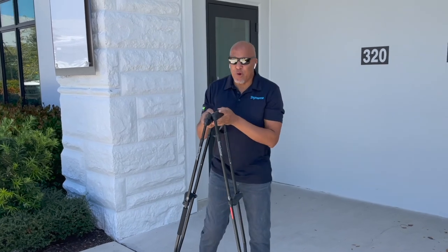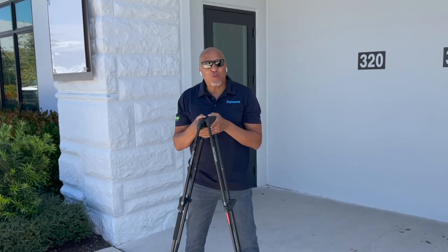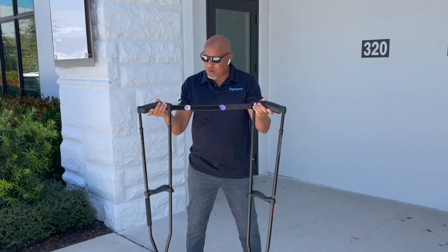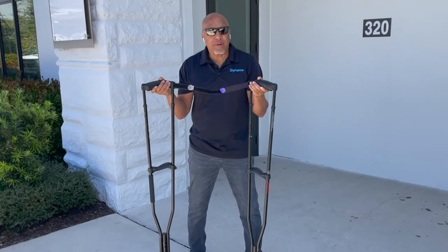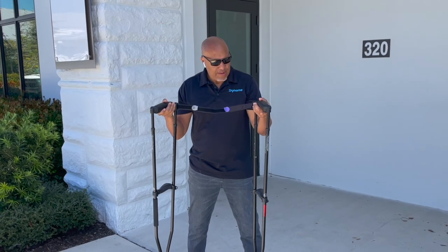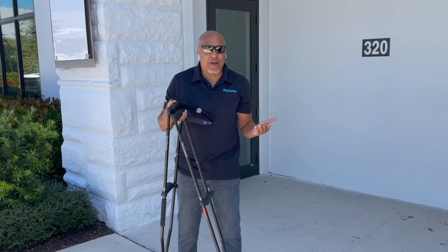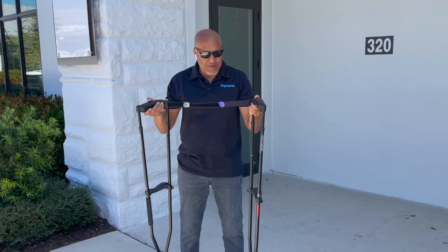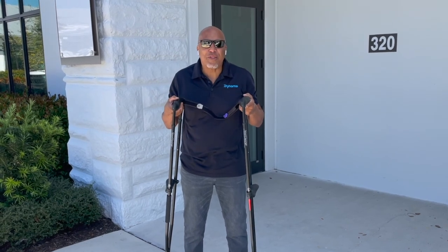Hey, I just wanted to take a moment and do a Q&A on the Dynamo Sport Swings. Today I'm holding the black ones, which are designed for someone that is about 6'1". I am 6'2", 210 pounds, and I'm 62 years old. I'm bringing this all up because I wanted to show this in some type of perspective for the proper fit.